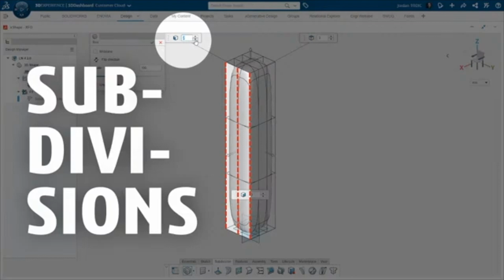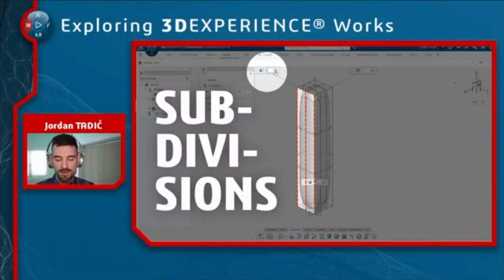The next thing that you're prompted with is why we call this subdivisional modeling. How many subdivisions do you want on the model? So you see those 3 vertical lines going down the length of the model. But you see in the dialog box that's circled, I've only selected 2. What that actually represents is the columns of faces that you want along that singular face of the model, or side of the model. And in this case, I know that I want symmetry down the center of the finger from right to left. So I want to place a line where my symmetry line is eventually going to be, and that's just going to make the model update a lot more predictably when I add that.